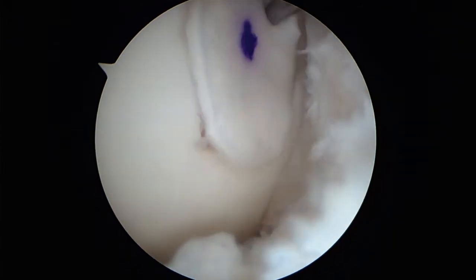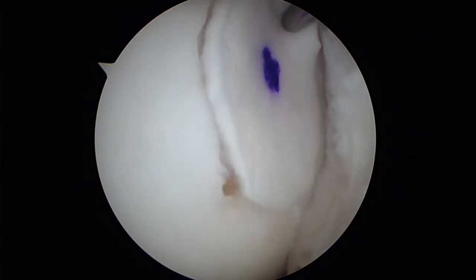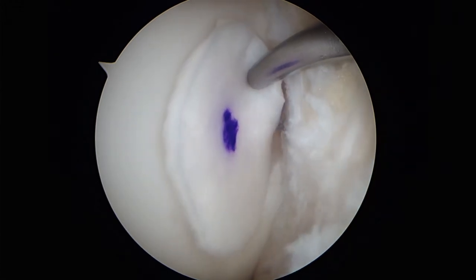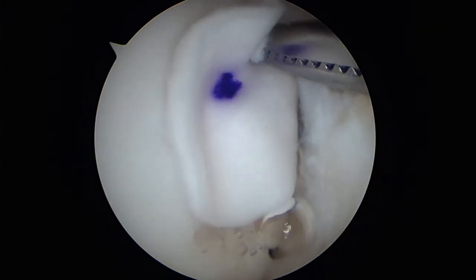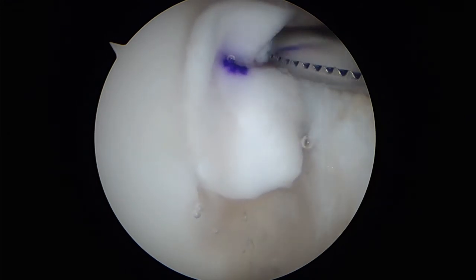The membrane is placed into the defect and should reside flush with the chondral junction. Fibrin glue is added as an adhesive between the membrane and the defect. Start with the application of the fibrin glue at the top, and gravity will make the glue flow down to the lower part of the lesion.